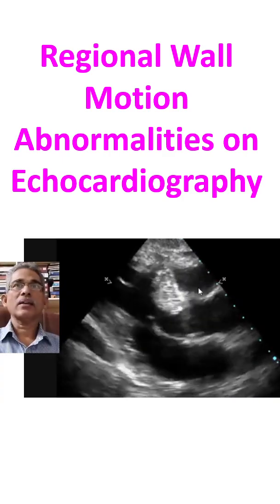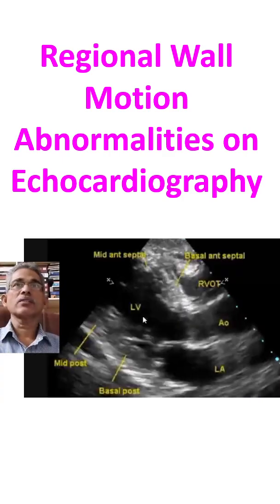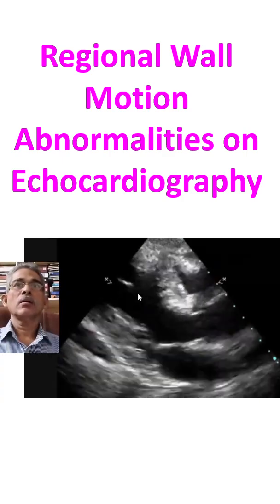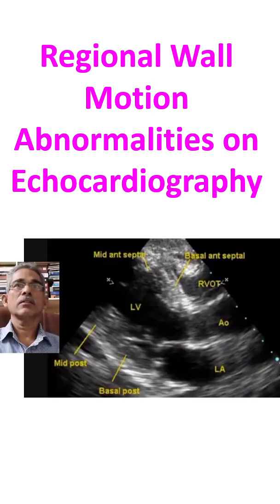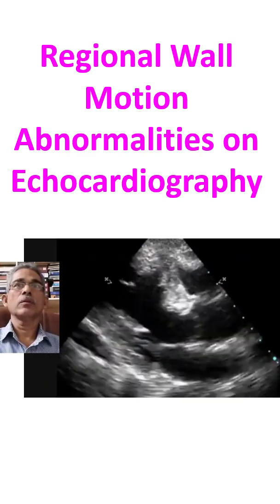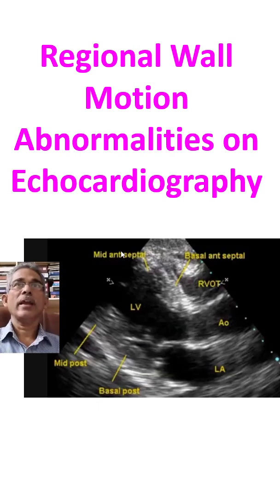This is the parasternal long axis view. I will show it once again — the frozen view. The various segments have been labeled here. This is mid-anteroseptal and this is basal anteroseptal.